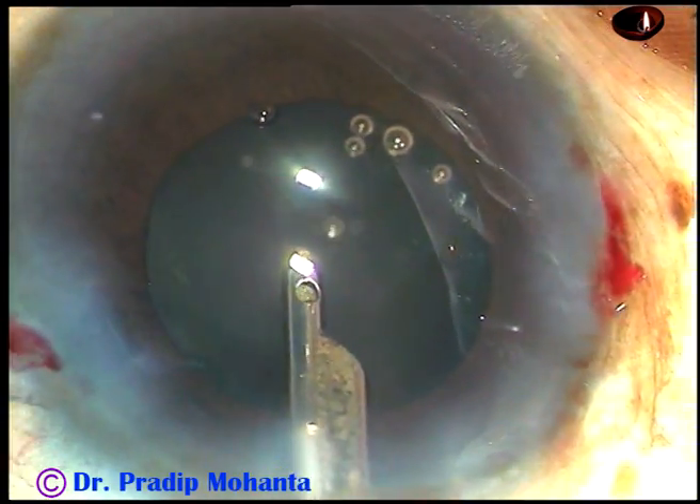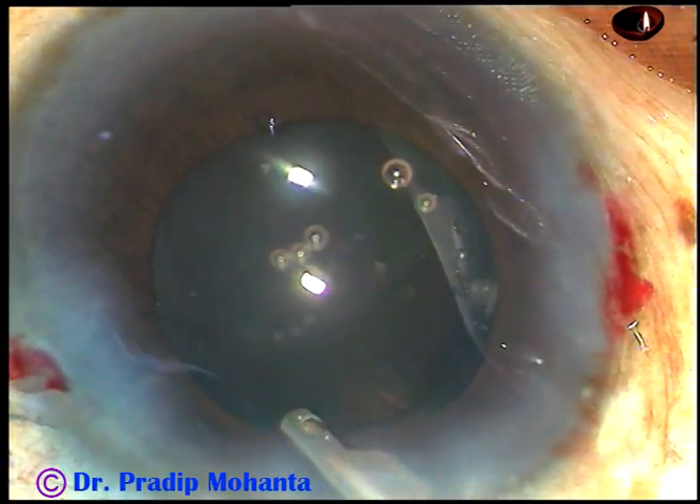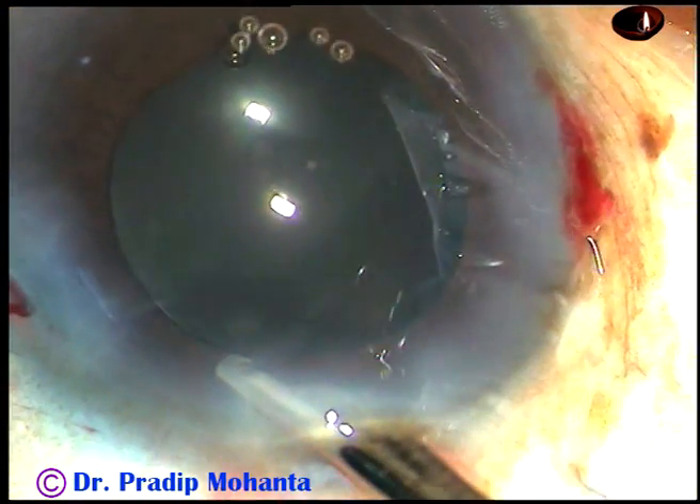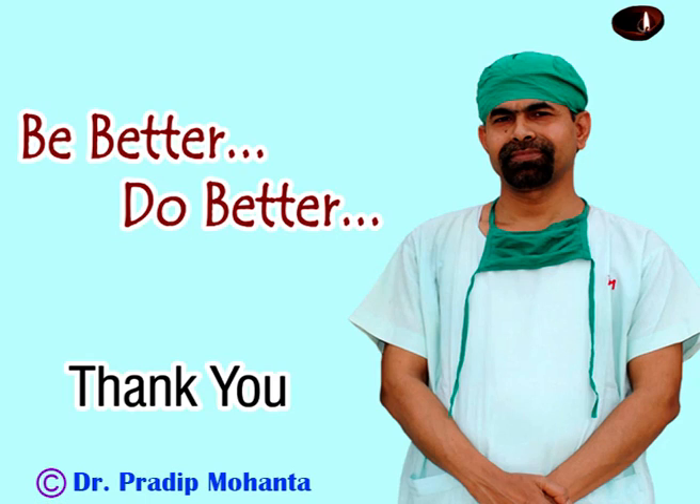Lens tilt technique is a very good technique for soft cataracts. Whenever you think that it will not be able to hold, you can employ this technique. Thank you very much for watching. Hope this video will help you in improving your surgical skills. Be a great surgeon.